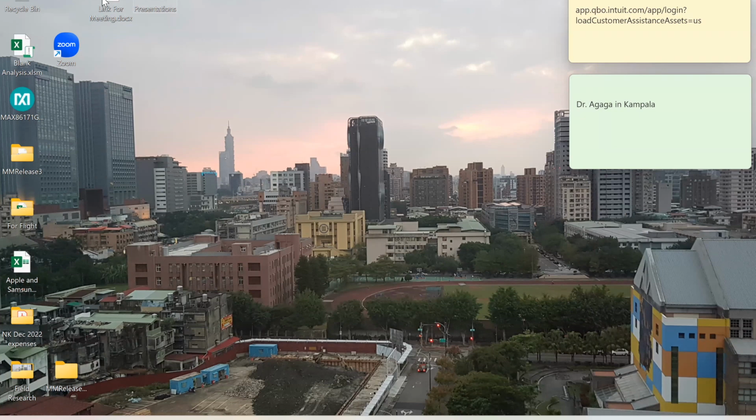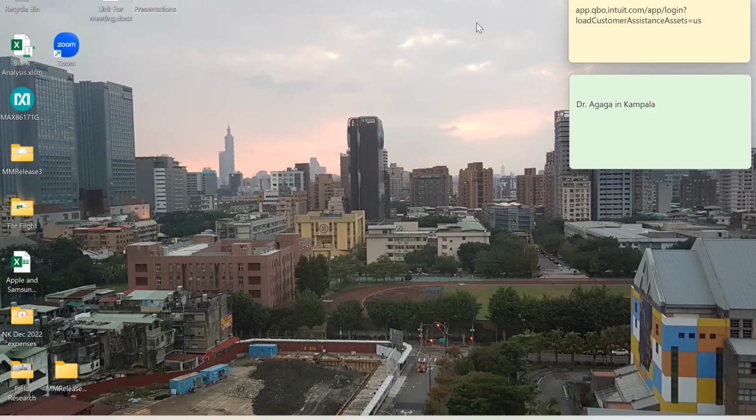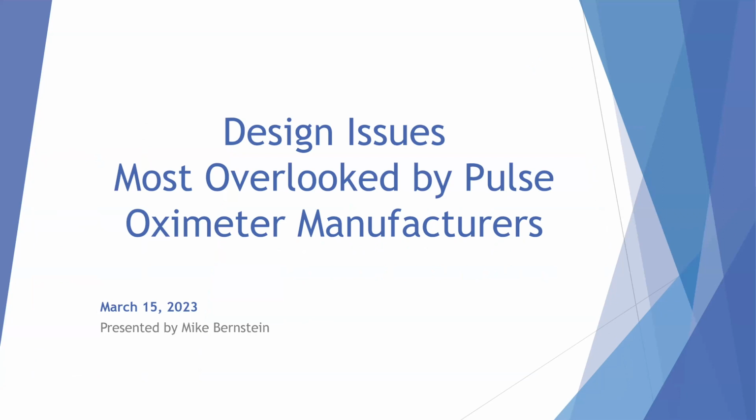There's a question from Cameron McGuire about using perfusion index as a correction factor. And I think that could work if you also account for degree of hypoxemia. So it's more than just perfusion index. In our data, you see that in light skin, low perfusion does not produce this error. So you've got to include more than just the perfusion index in a correction factor. It's a complex interaction. You talked about pulsatility though, right?